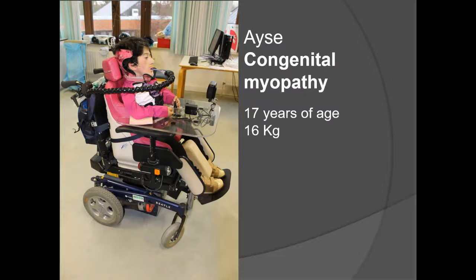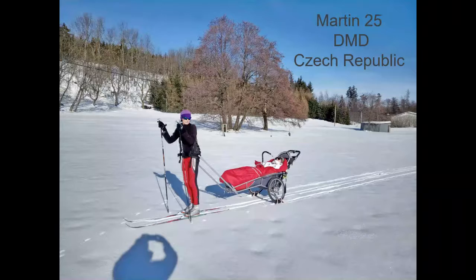This is another fantastic slide of a patient with whom I implemented the mouthpiece in Prague 6 years ago. This guy was 19 years of age at that time, was 20 kilos, and only by using the mouthpiece during the daytime, he gained some 20 more kilos.